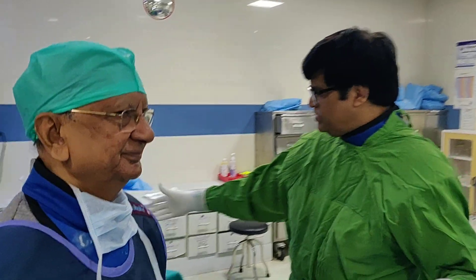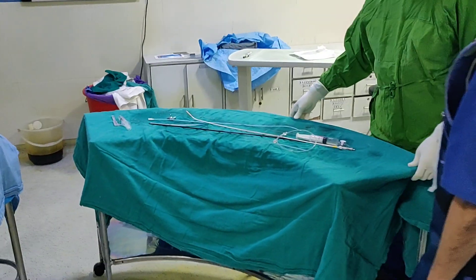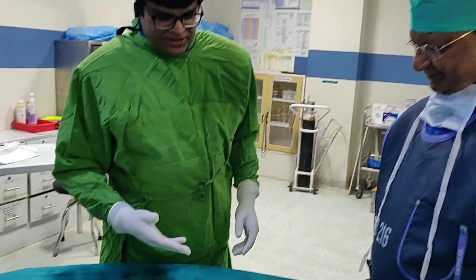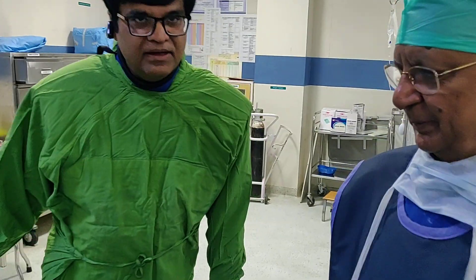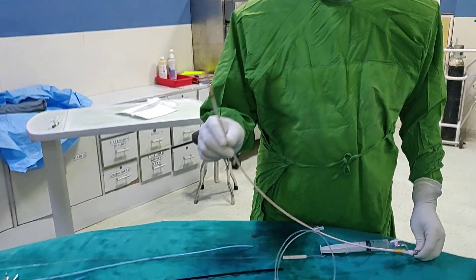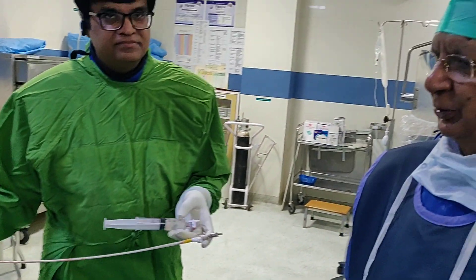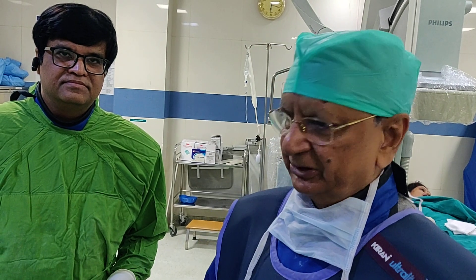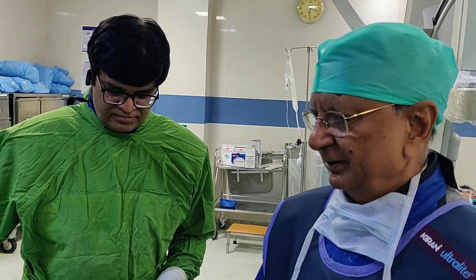Dr. Gupta handled most of the case here. This is the balloon which was invented and innovated by Dr. Inoue. As we all know, this is different from a coronary balloon. Dr. S.K. Gupta made the preparation of this balloon. The balloon at the tip of the catheter needs to be prepared before introducing it to the patient. The measurement requires us to measure the patient's height in centimetres, from which we calculate which size of balloon to use. The formula is based on height — this patient had a height of 151 centimetres, so we used a balloon of 25 millimetres in diameter. We chose the catheter accordingly and then did the valvuloplasty.